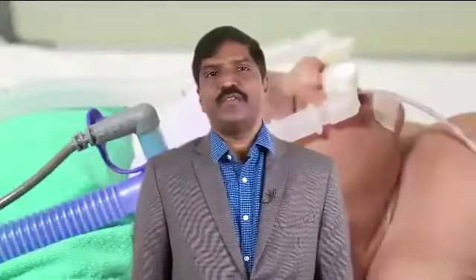Whenever a newborn is supported on CPAP, the ideal CPAP pressures are from 4 to 7 centimeters of water. CPAP pressure of less than 4 centimeters is not indicated and that greater than 7 centimeters is associated with complications such as air leaks, CPAP belly and airway discomfort.